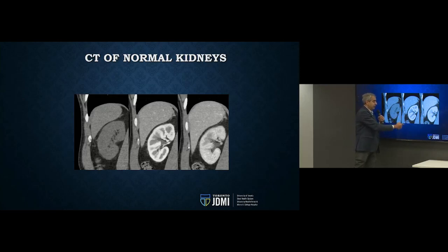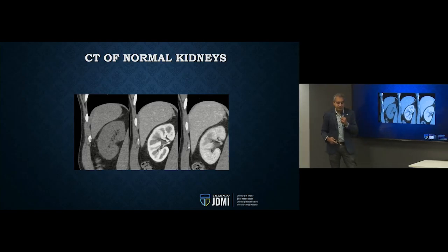So we time this, and that's called the corticomedullary phase, or also called the arterial phase, so an earlier phase of enhancement.